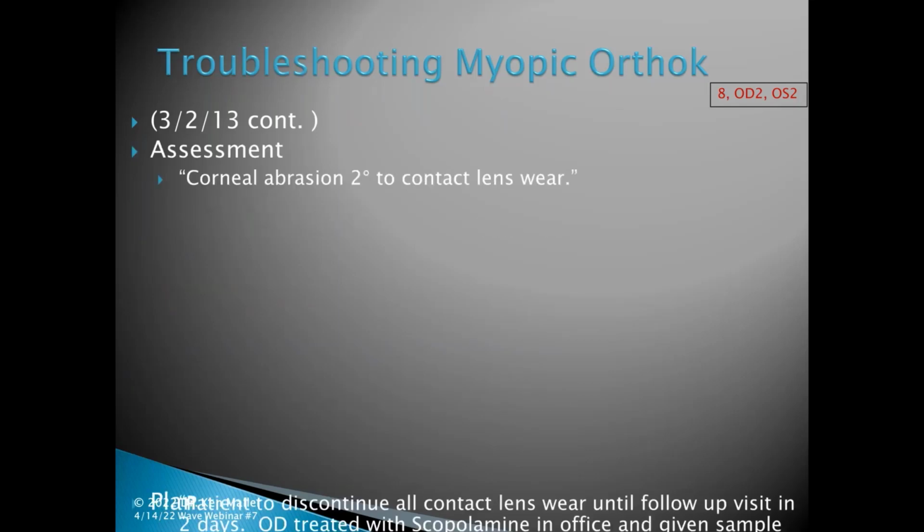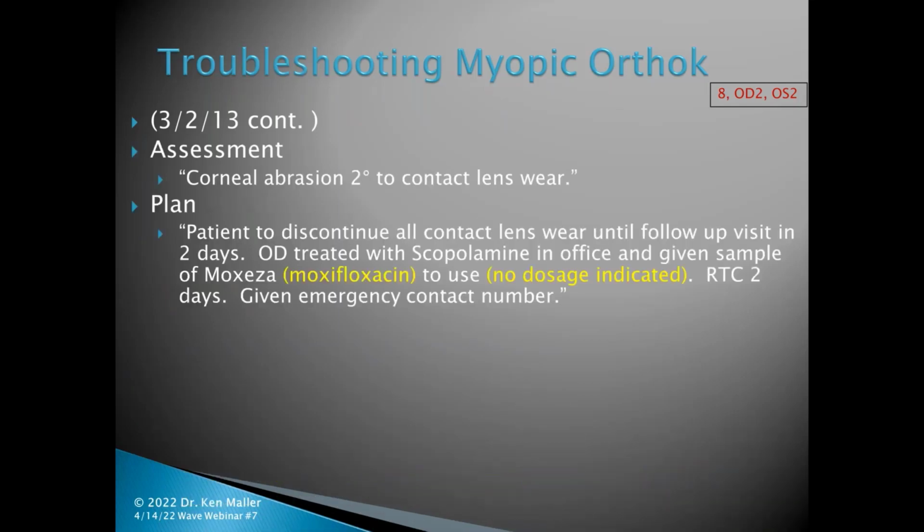We take a look at the assessment. He has an abrasion on the right eye, secondary to the contact lens wear. He was instructed to discontinue all contact lens wear until the follow-up in 2 days.